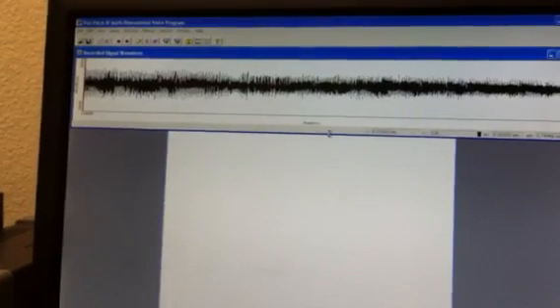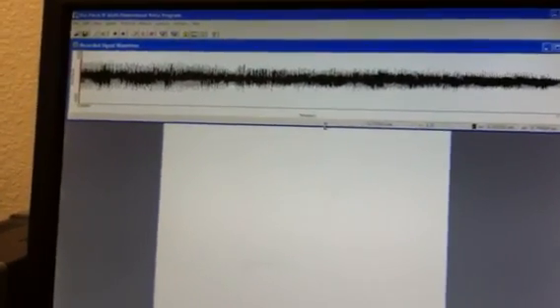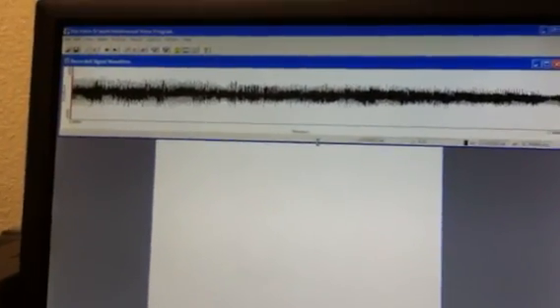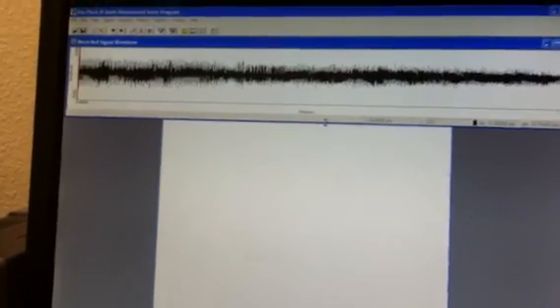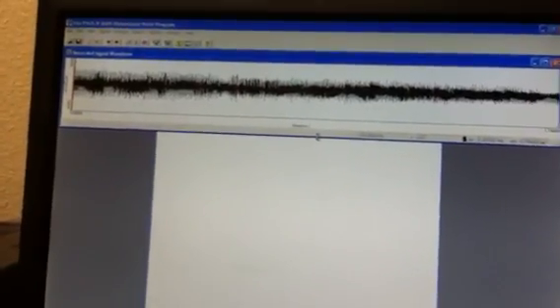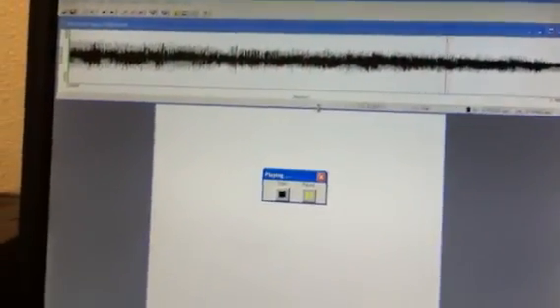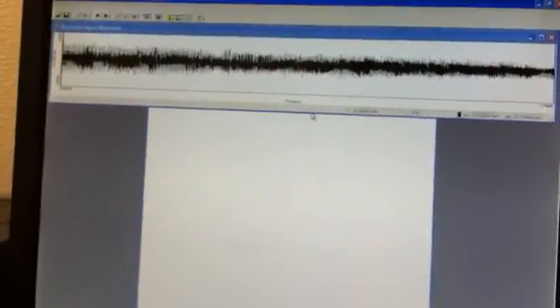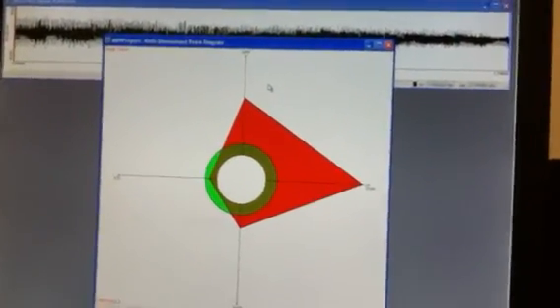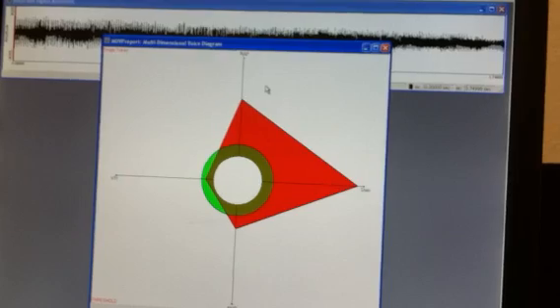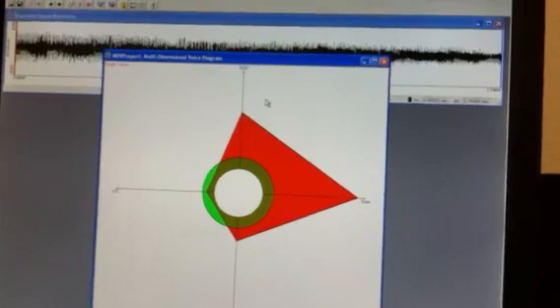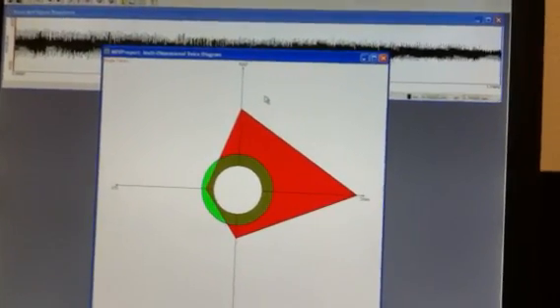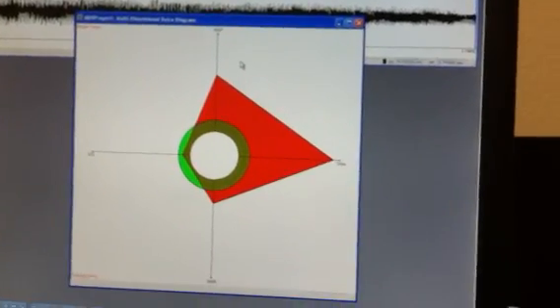You were able to see how I allowed the data to overlap. I did this because perturbation is highest at the onset of voicing, so I wanted to eliminate the onset of voicing. That's why I allowed the data to overlap.